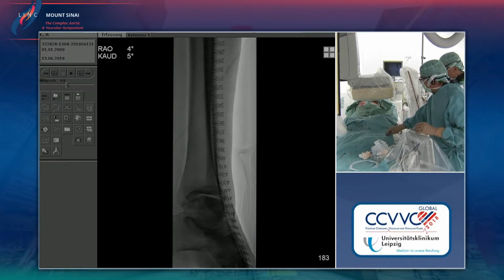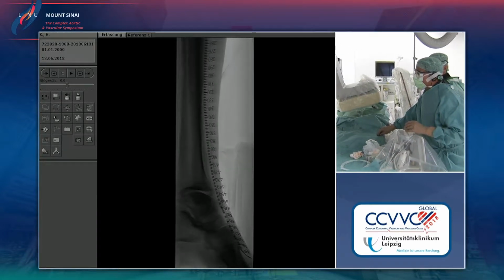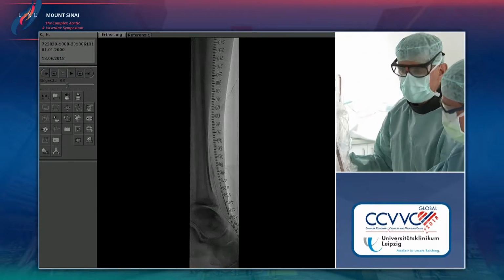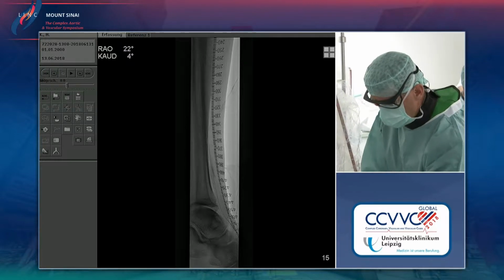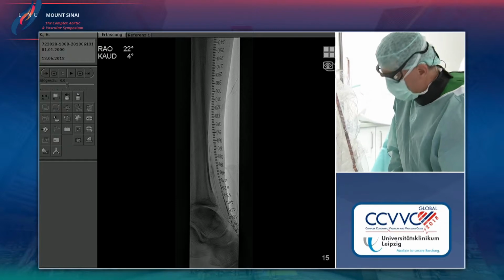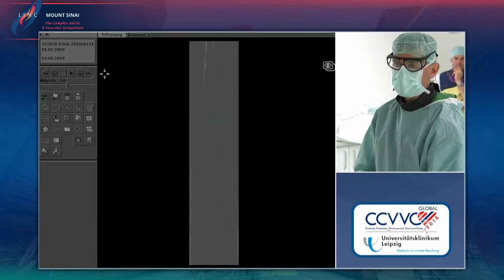Yeah, actually the 2 millimeter balloon already was painful for the patient. Therefore, I'm not sure whether I can really go up to 3 here. I think 2.5 may be maximal. Maybe it was also the length of the balloon which was painful. That's my hope. Not so much the diameter, but probably also the diameter.